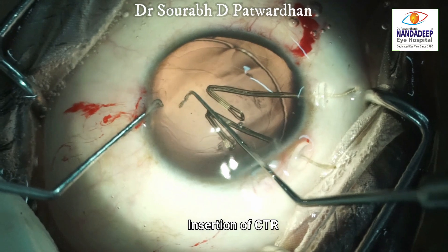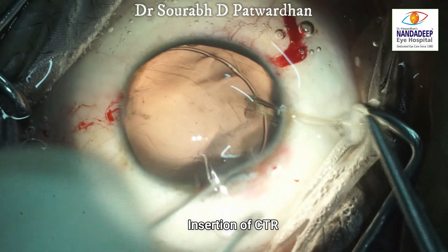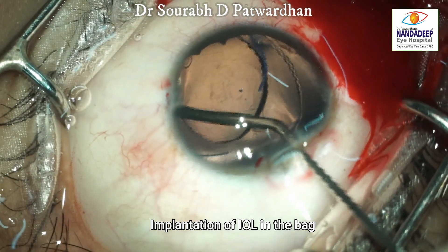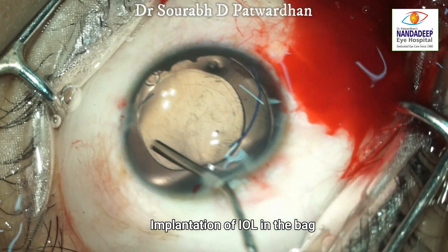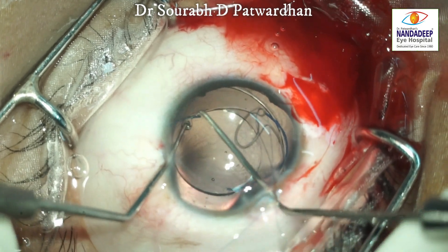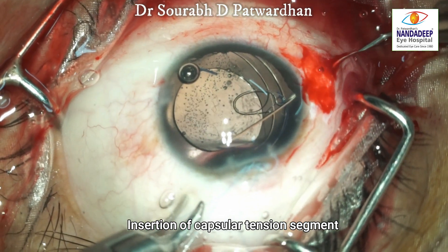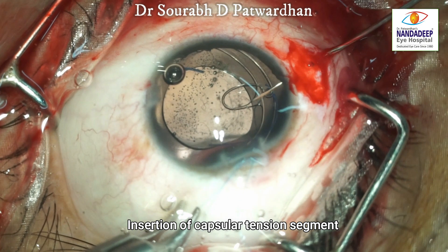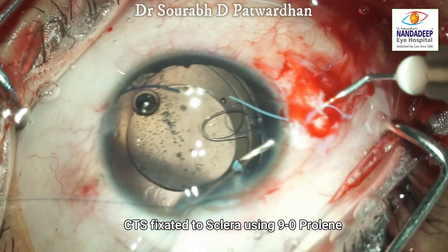Once the CTR is in the bag, you can see that the subluxation is more than six clock hours and that's why the bag is still not centered. So I am going to place the IOL first. You can use a single piece or three piece IOL, and if you are using a three piece, you can orient the haptics towards the area of subluxation. Now I have inserted a CT segment. Through the eyelet I have already passed the 9-0 prolene, and I am using the railroading technique in reverse manner so that the sharp tip of the 9-0 prolene needle is away from the bag, thus avoiding accidental puncture.